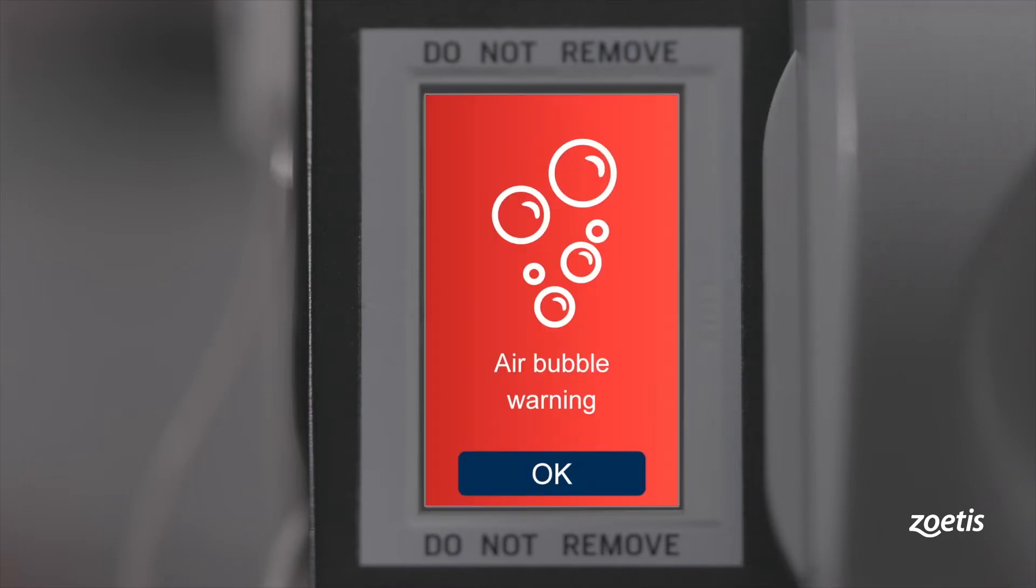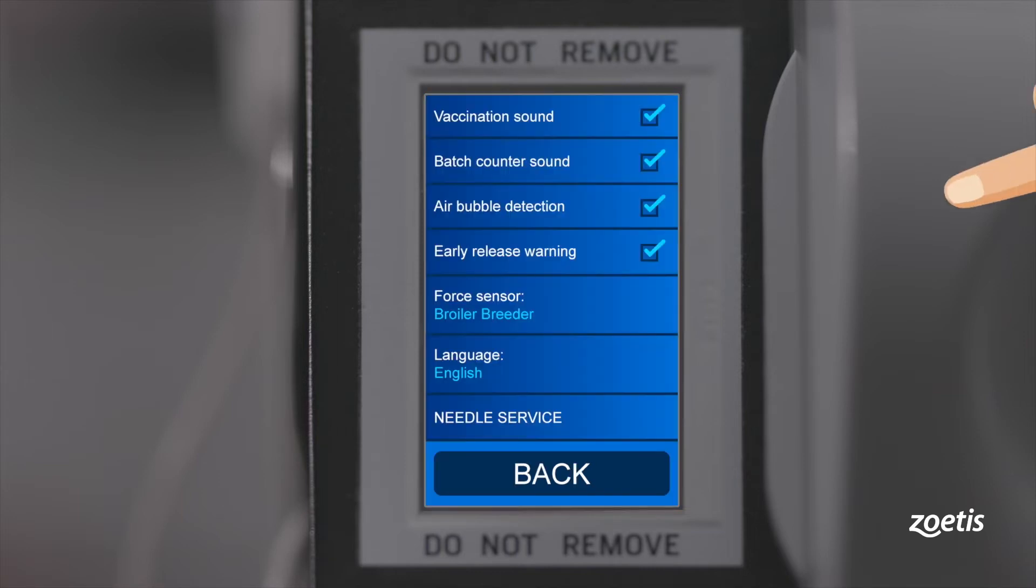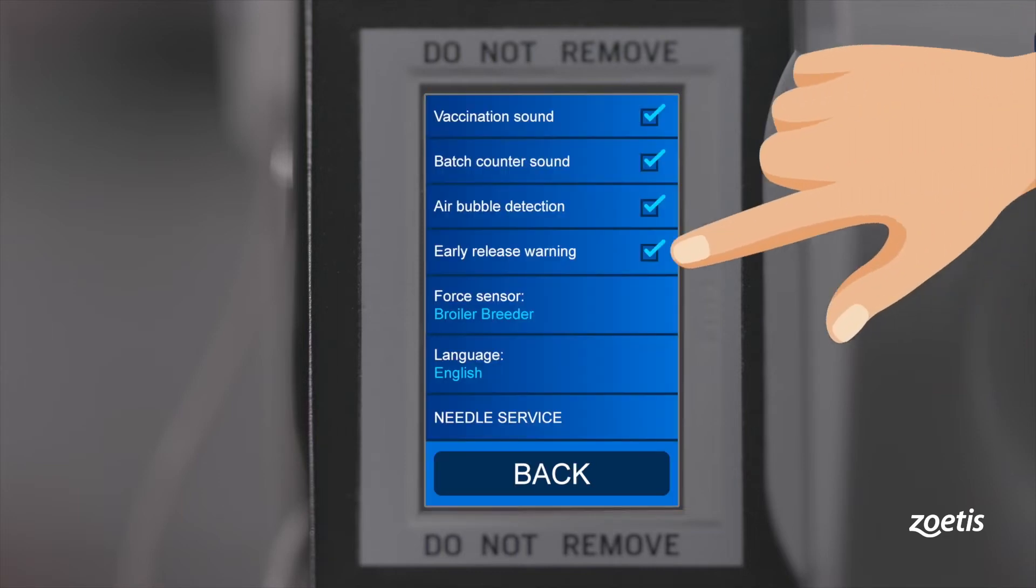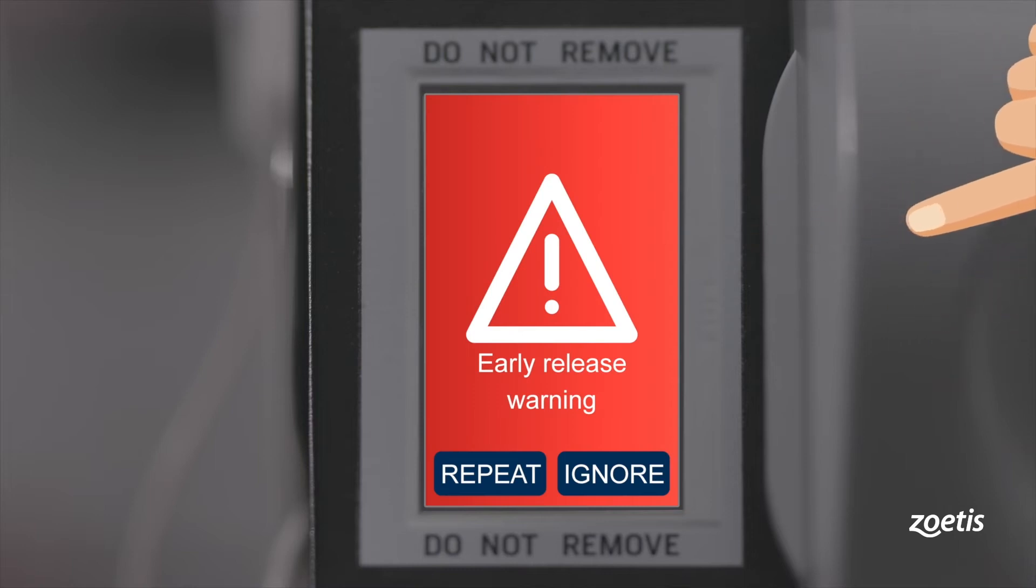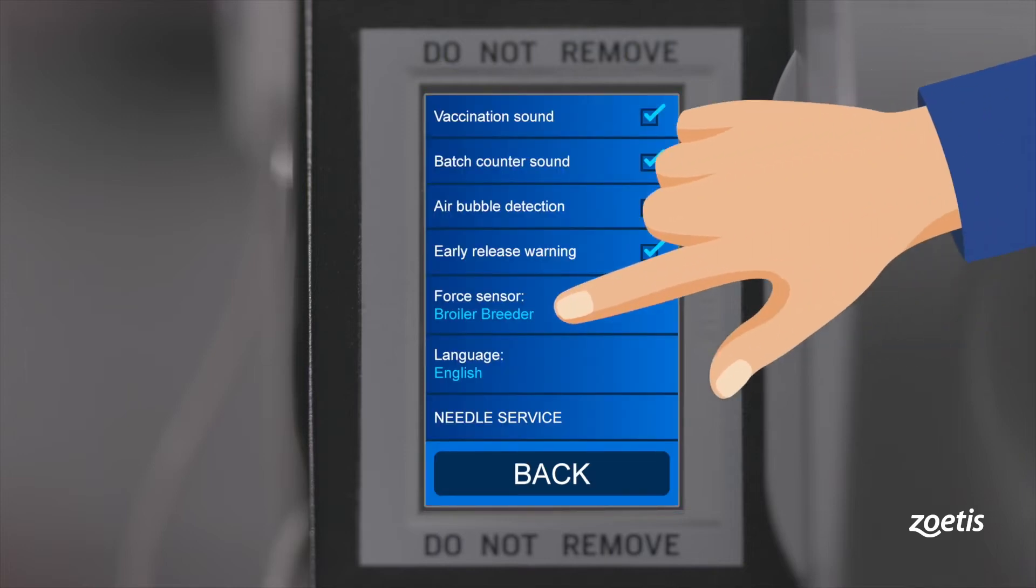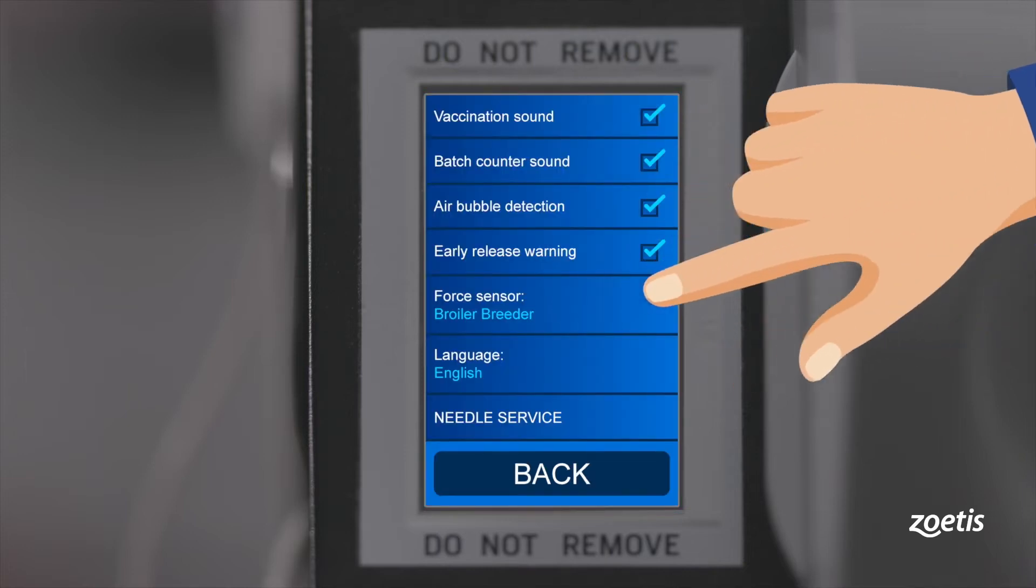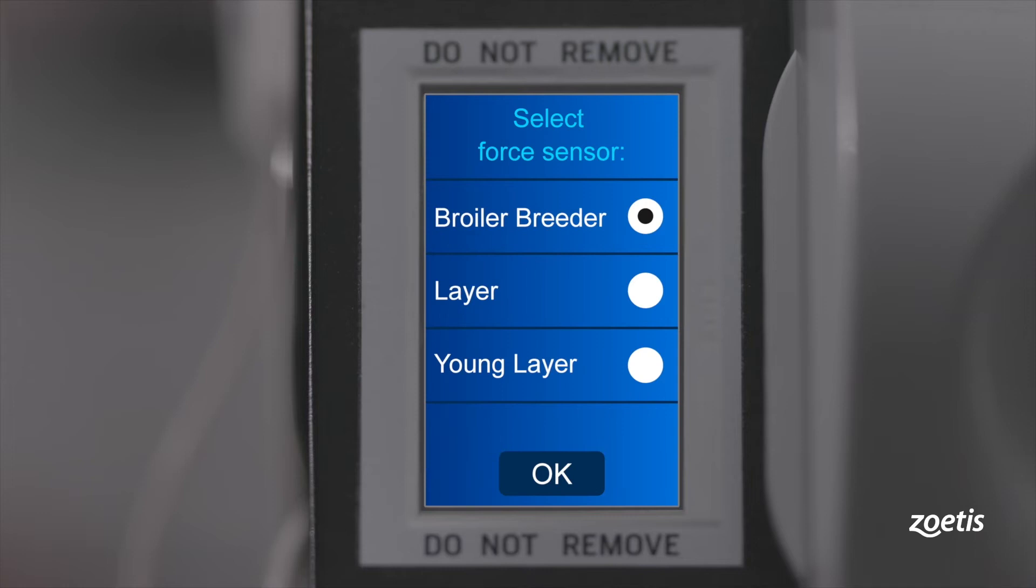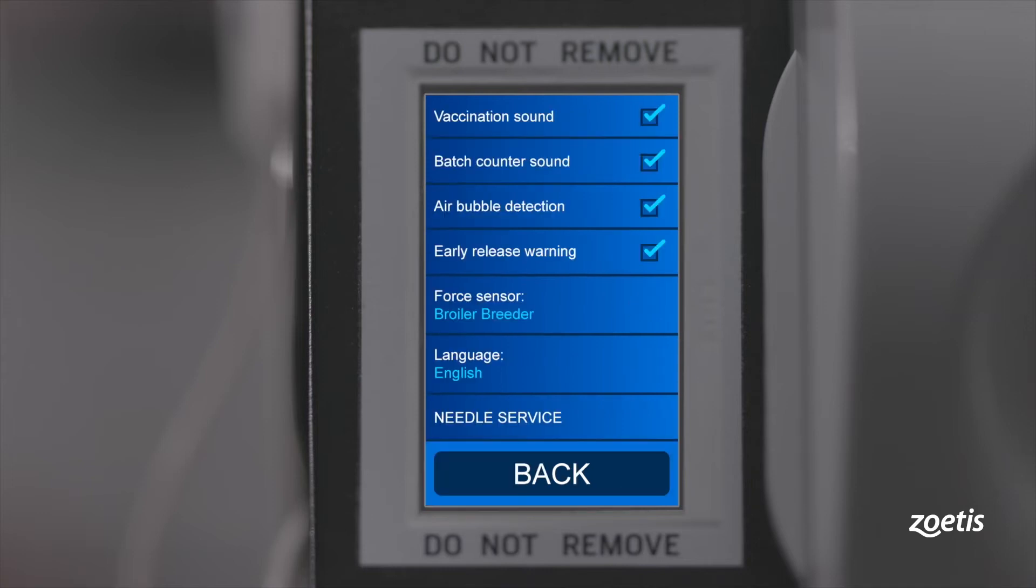Air bubble detection: this safety feature detects air inside of the tubes to prevent air being injected into the breast muscle. The early release warning will emit a sound if the chicken is released too early. It is possible to either repeat the injection or ignore the warning. Force sensor: depending on what type of chickens you are going to vaccinate and which breastplate you use, the force sensor needs to be adjusted.